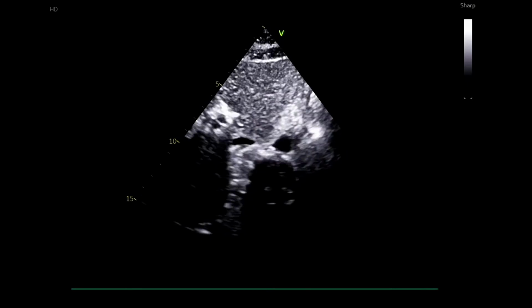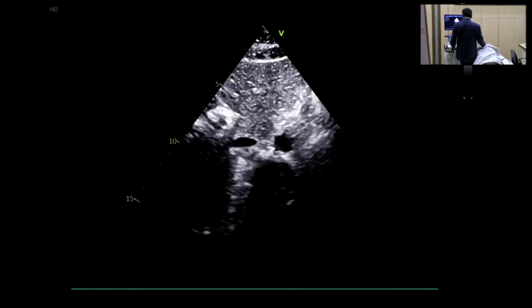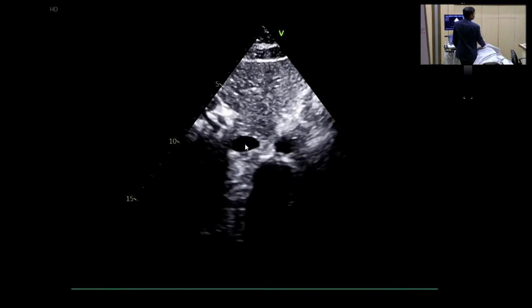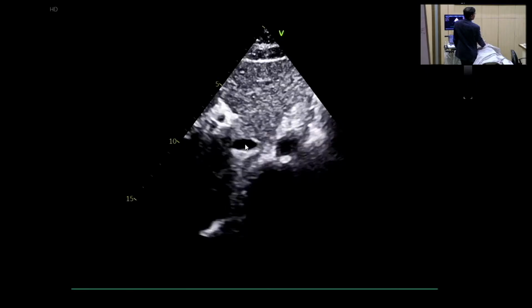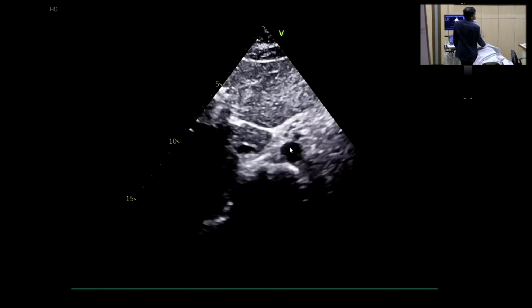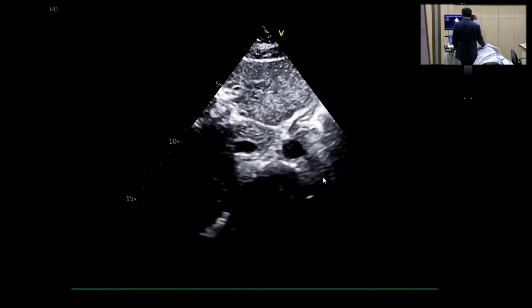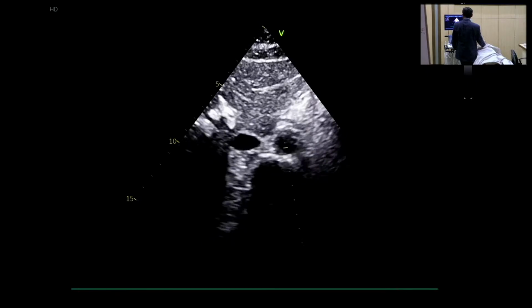So this is what situs, what structures again. So this structure, IVC. Why is this IVC? Respiratory collapse. Yes, collapse. This one, aorta. Why aorta? अब तो समझ से खाली है, बोलो. Okay. So situs inversus. Why?